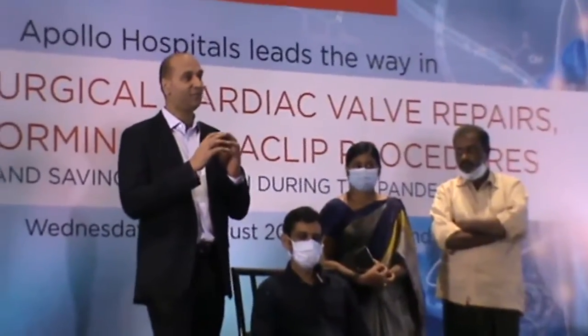The contraindications for this procedure: this procedure depends on the size of the left upper chamber of the heart. Now, I need a certain height to be able to take this clip, bend it, move it down and correctly clip the valve leaflets. This height is about 3.5 centimeters. Now you have to understand that we're doing all these movements in a 2 centimeter by 3 centimeter cube.